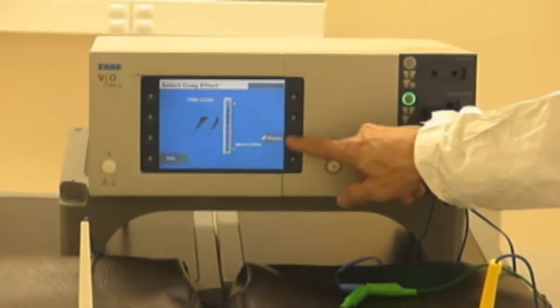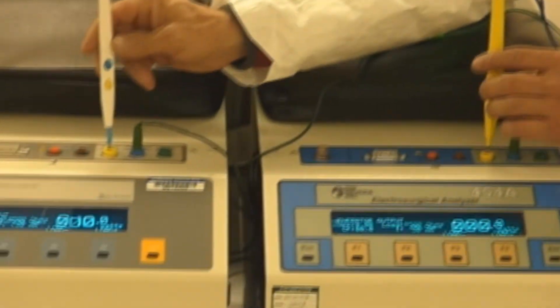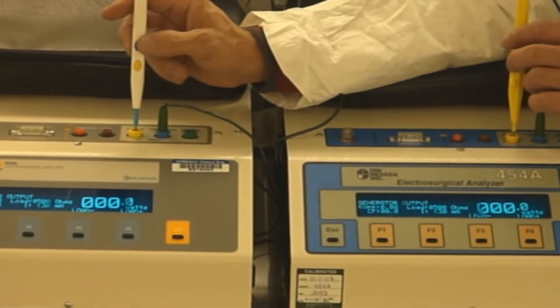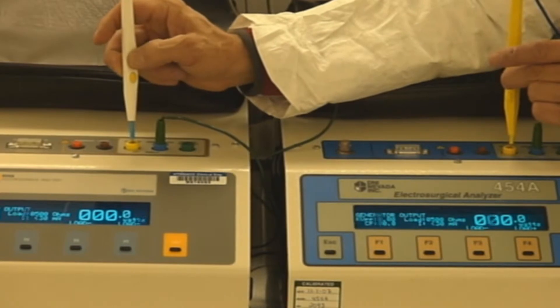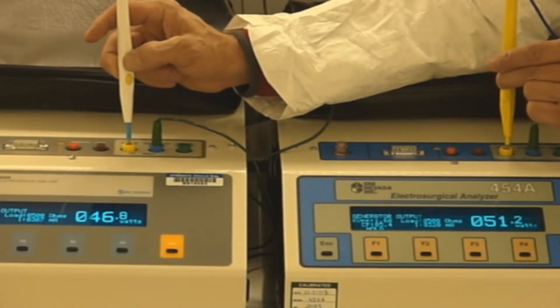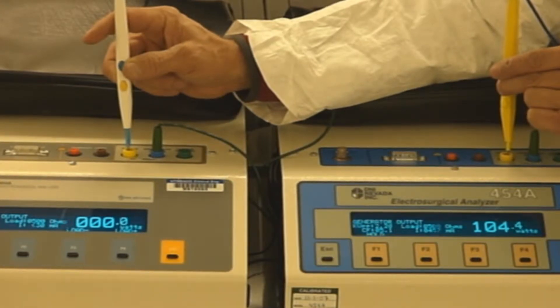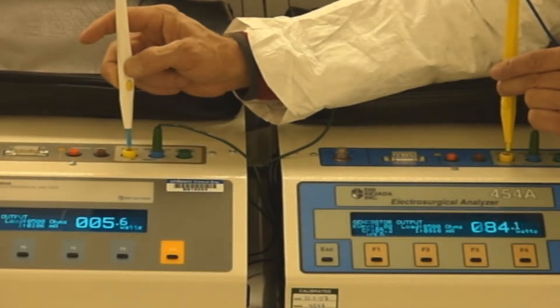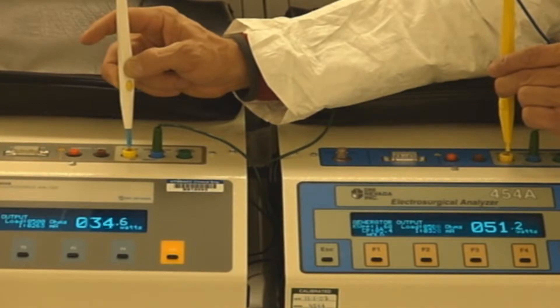Now we're going to go ahead and go to effect seven and do the same thing. Here again, we're at 500 ohms this time, that's the difference. Here we go, simultaneous activation. Surgeon one drops out, you saw the shift. Surgeon one comes back in, there's the split. Surgeon two drops out, there's the shift. Surgeon number two comes back in, and there's the split.